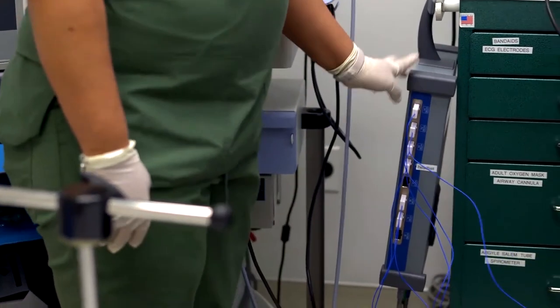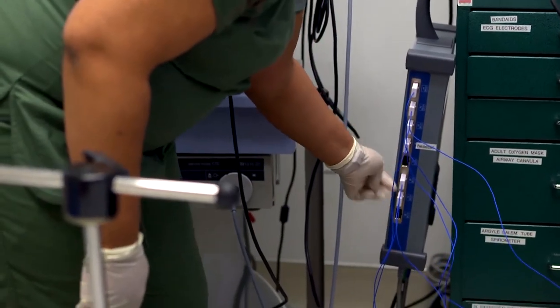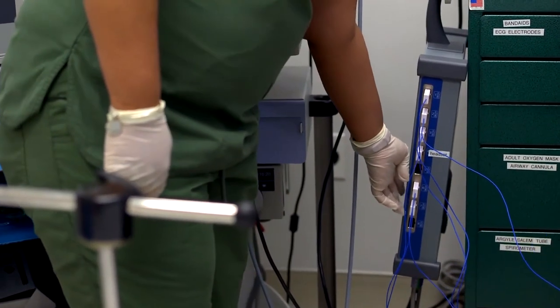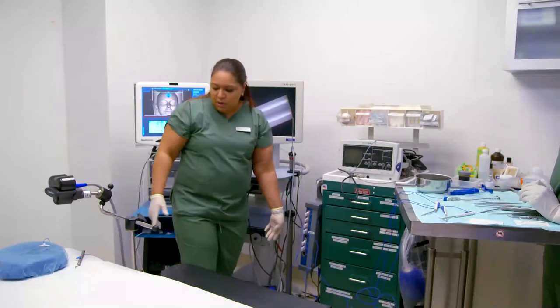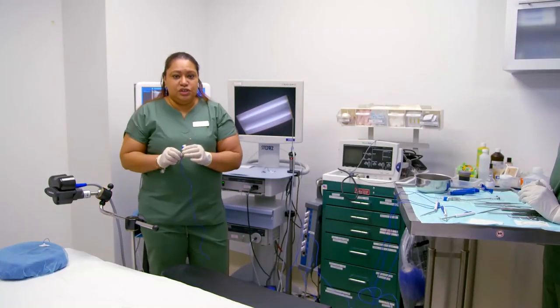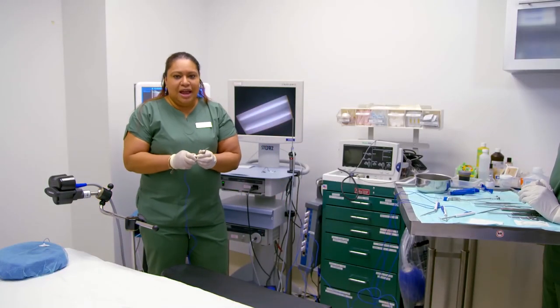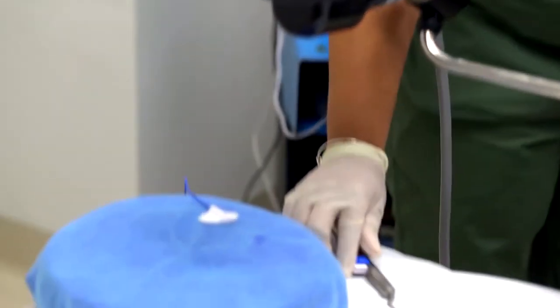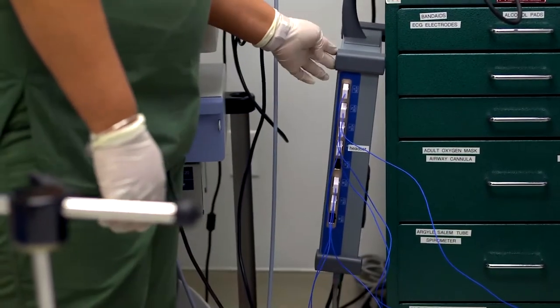As you could tell, the Axiom Box has 8 ports and there are some extra ones. We would really not be able to use them. I mean, we will use them, but not in this case, only because once we use the registration tool, we will take this one out and just use it in one of the other instruments. But there is space for you to use all 8, and we're all set up. Thank you.